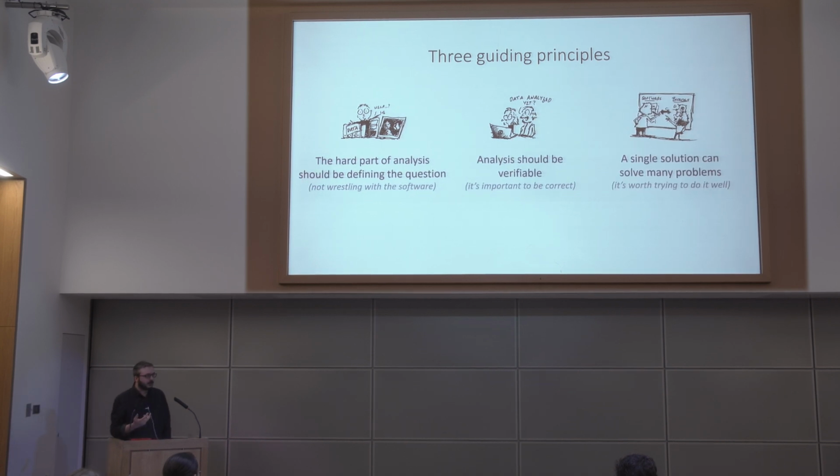But I do think that in research, there are so many different problems that we're working on. And with image analysis, almost everything needs a solution that's in some way customized. But if you can come up with software and algorithms that span across different applications and implement them in a reasonable way, then they can have a big impact, because lots of people can use them. And they can use them in new and inventive ways, and they can do much more with them.